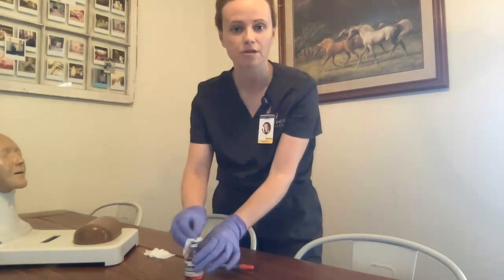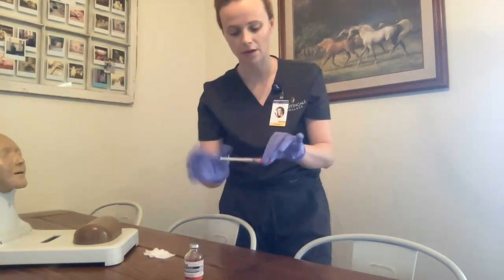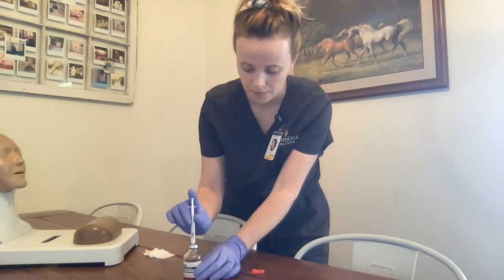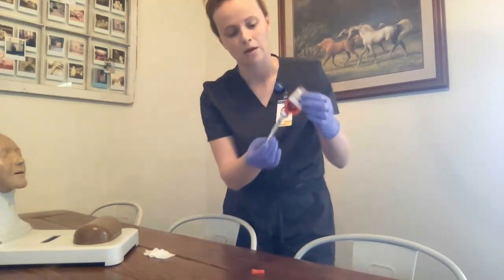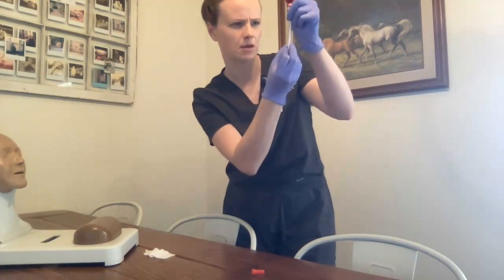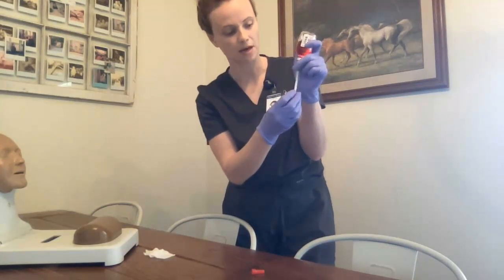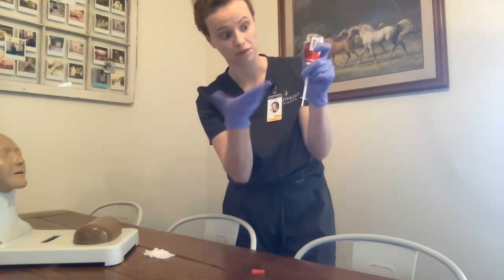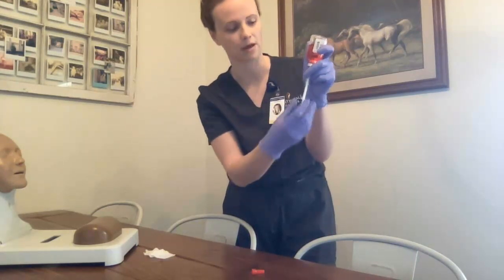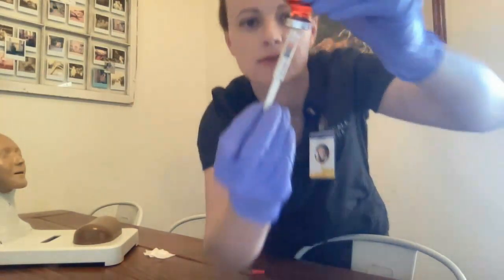I will then clean the top of my medication vial with the alcohol swab and dispose of it in the trash. I will then remove the cap, inject the air, invert, and draw out the solution to the desired amount of 0.1 milliliters. When drawing out solution, sometimes air bubbles can appear in the syringe — I either need to tap it to remove them, or sometimes inject the solution back and draw again. There are no air bubbles present and it is at 0.1 milliliters.